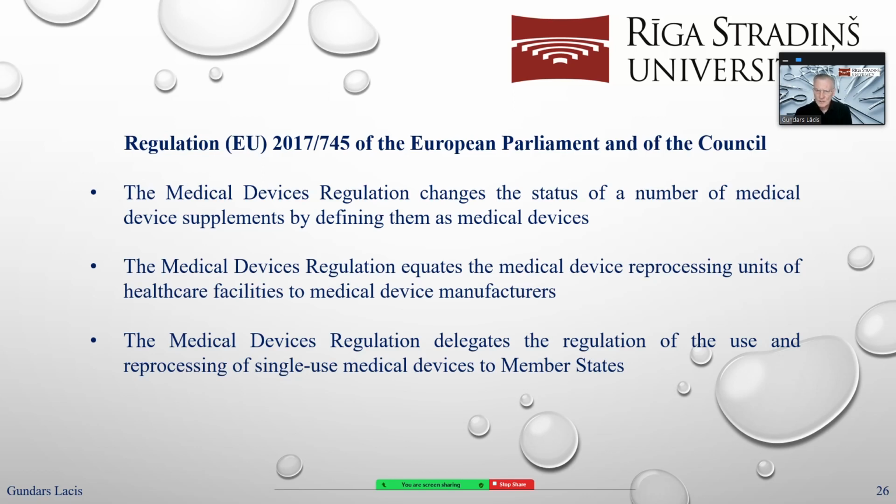And why? Imagine, for example, a medical device manufacturer, maybe it's B. Braun or KLS Martin or whatever. They are producing medical devices, forceps, clamps, retractors, and whatever. They always know the possible contamination of their instruments when they are manufacturing them, and they have really strong and precise regulations on what they have to do with those instruments.